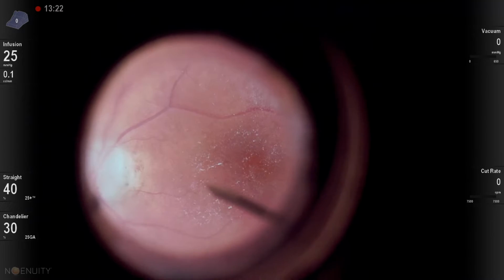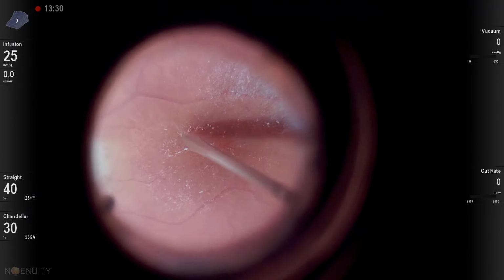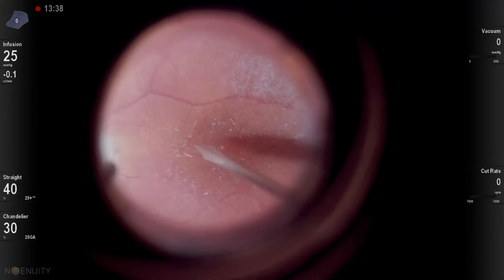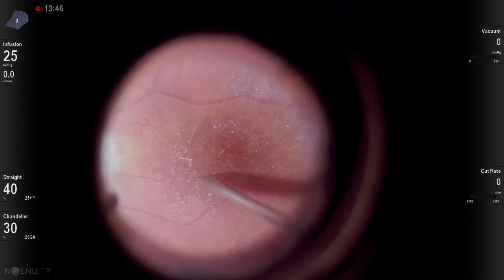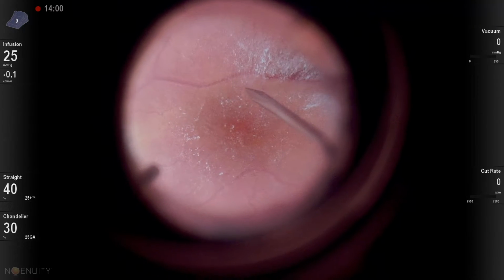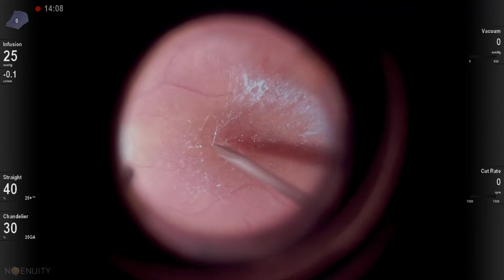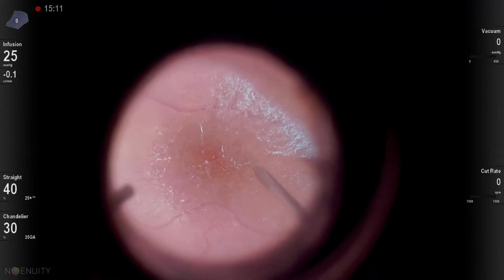Using a membrane pick instrument, the surgeon makes small openings in the posterior hyalloid around the foveal region. Note that he makes centripetal movements to perform these openings, aiming to isolate the parafoveal hyalloid from the peripheral posterior hyalloid, and takes great care to avoid generating traction on the fovea and consequently creating an iatrogenic macular hole with his maneuvers.